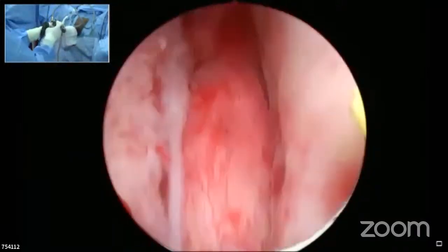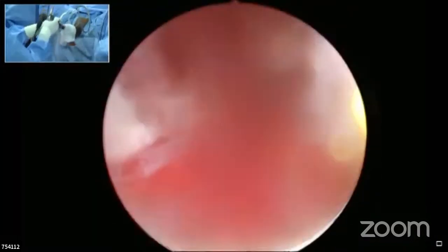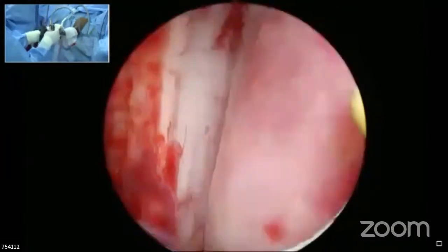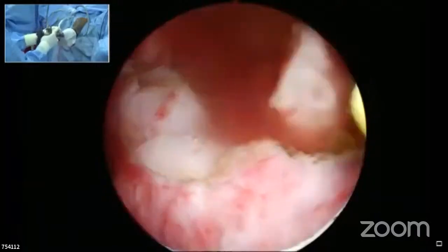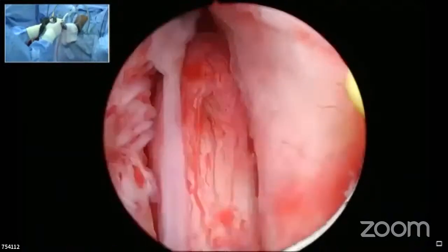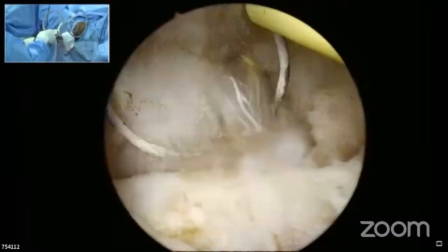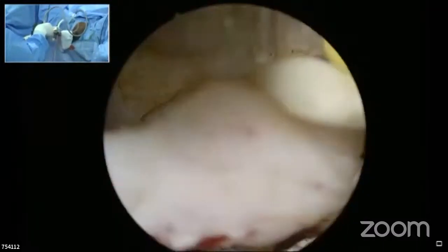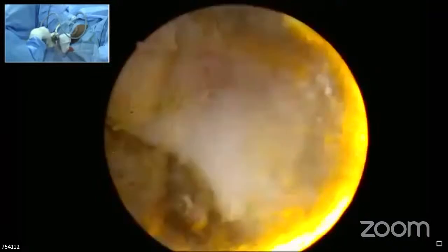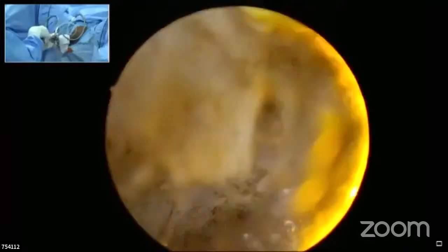Well, most of the lateral glands are done, what is remaining now is the apical tissue. So we come back, reorient ourselves. This is the eventual region of the sphincter where we don't want to reach. But yes, this is the verumontanum and this is the apical tissue which is left. As was demonstrated in the first case, what we have to do is not recede back, stay here and keep moving, and the angulation of the working element keeps moving. So shortcuts in an angulated way would help preserve the mucosa and the sphincter and scoop out the adenoma which is extending beyond.